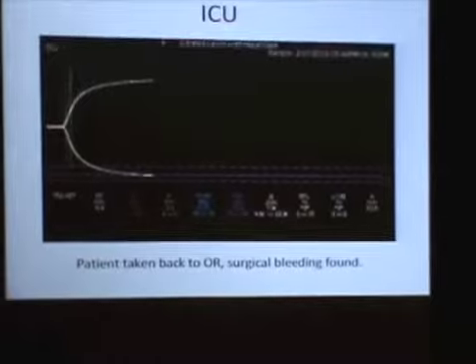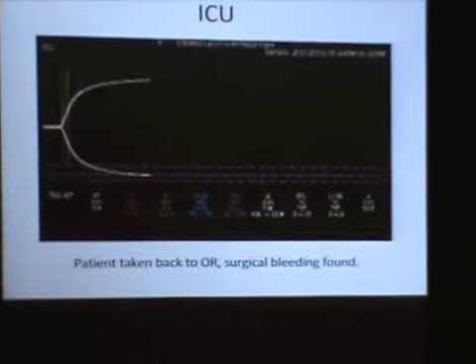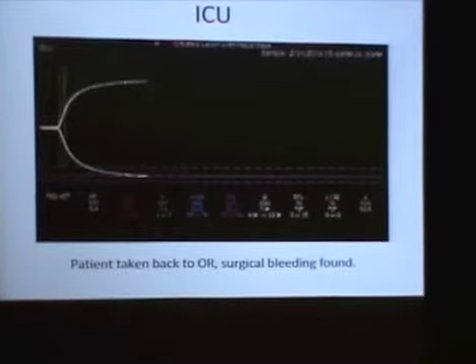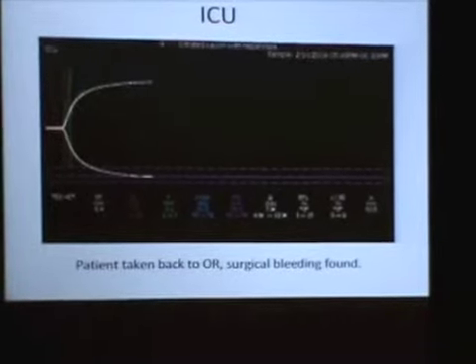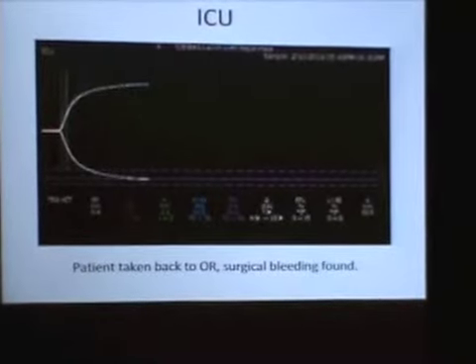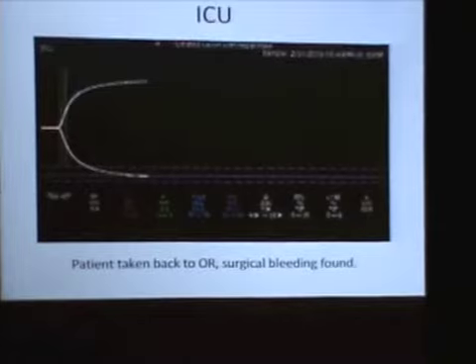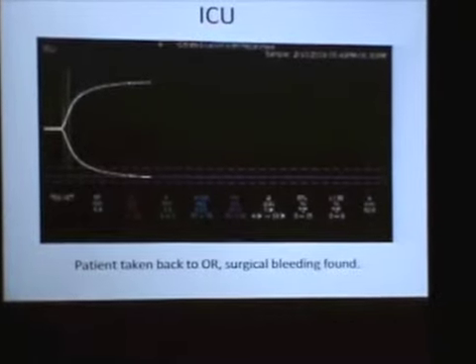If I have a patient in the ICU who is bleeding and I want a TEG, how long until I get it back? It takes half an hour to run the assay, and if you send a blue top tube, the lab has to wait 15 minutes from draw time before they can start the sample. And it takes about 30 minutes from that sample point. So the result will be within 45 minutes? Yes.